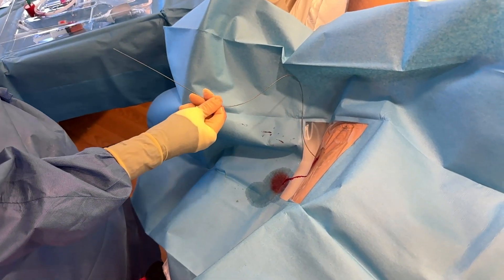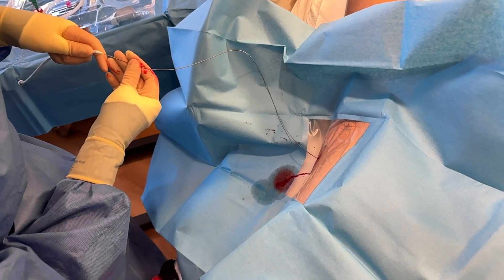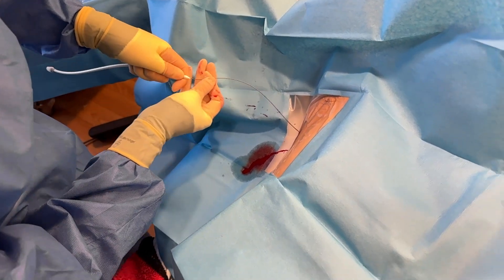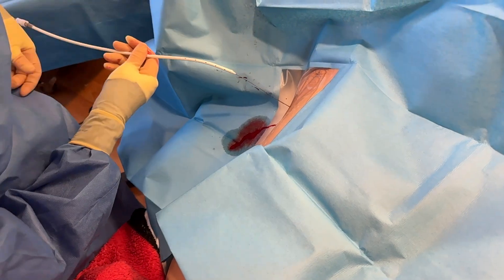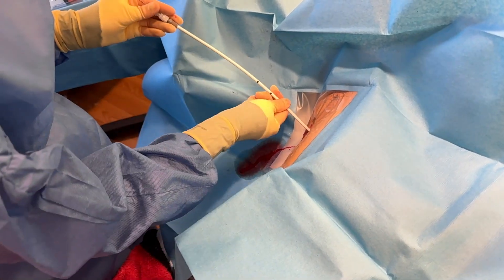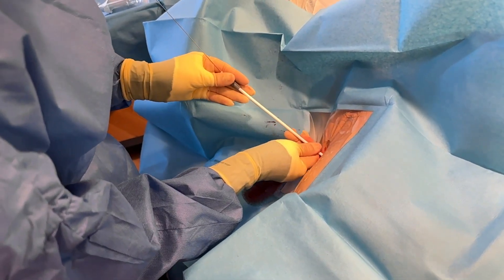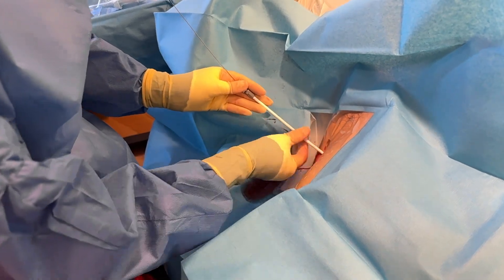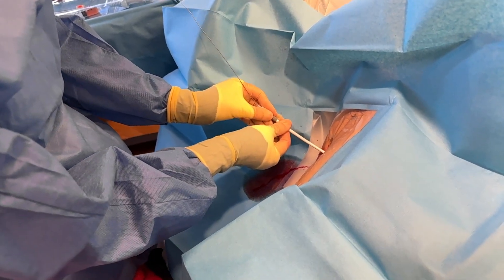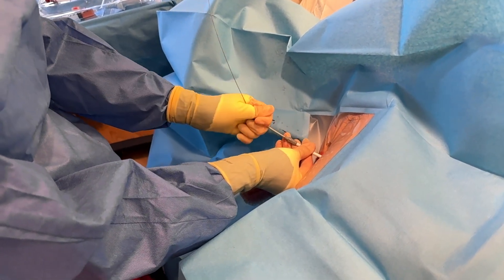The provider announces drain insertion: 'I'm going to insert the tube now.' The patient is reassured throughout with 'You're doing great.' Depth guidance is provided: 'All the way to the third line — that should be nice and deep. You can always be too shallow but never too deep. It's nice and deep.' The dilator is removed: 'I'm going to take out the dilator — that tube's going to curl like we talked about in the picture.'